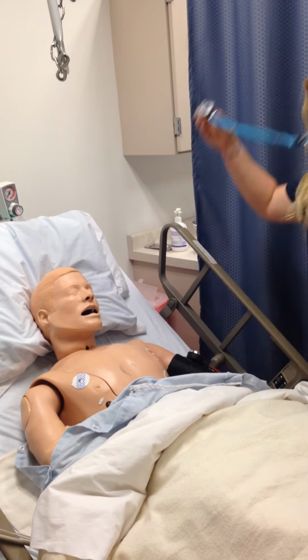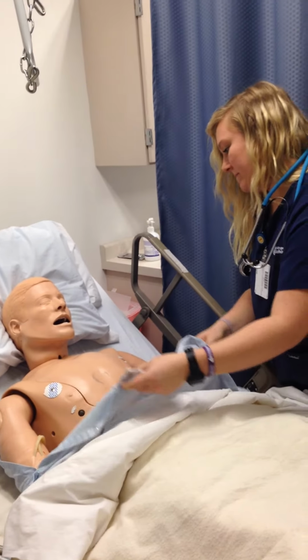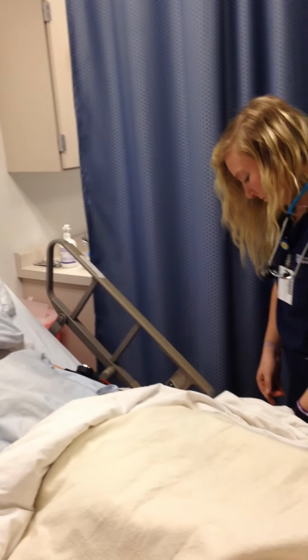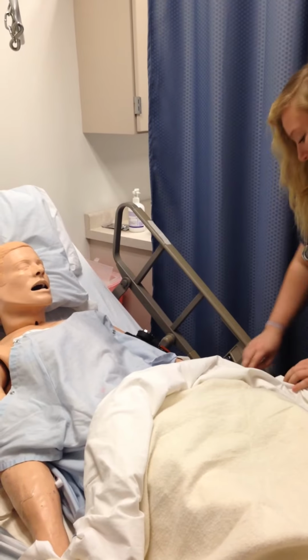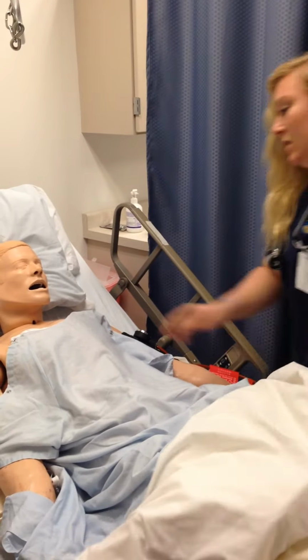And then I'm going to ask for temperature, O2 sat, and then take his blood pressure. Then I'm going to check for cap refill. And it's less than 3 seconds. I'm going to have him squeeze my hands bilaterally, and then take his pulses bilaterally. And I'm going to move down to the GI.